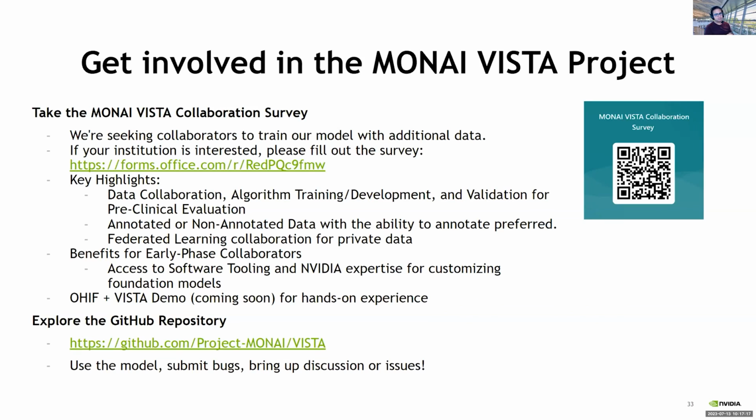Just like Holger was talking about in the session before this with federated learning, we're trying to take advantage of that, because we know that not all the data can be easily exported out of your institution. So we're setting up that infrastructure and figuring out how we can get people involved in training a better, bigger model for MONAI Vista. Some of the benefits of being an early phase collaborator: on the NVIDIA side, we have expertise that can help you customize this foundational model to your workload or things you're working on, and our general tooling infrastructure.